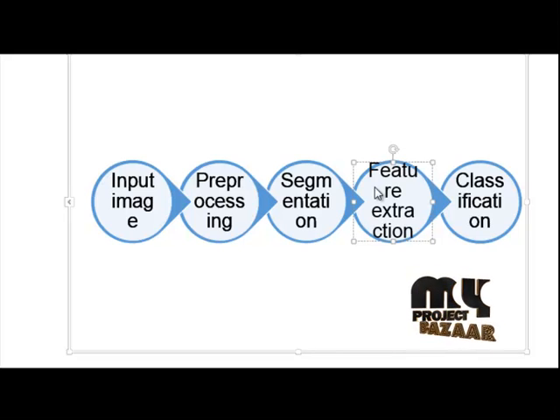The next feature extraction method is HOG, histogram of oriented gradients. HOG captures edge or gradient structures that are characteristic of local shape. It is an image descriptor based on the image's gradient orientations. We extract the mathematical values from HOG. The HOG descriptor is based on dominant edge orientations. The image is divided into cells.